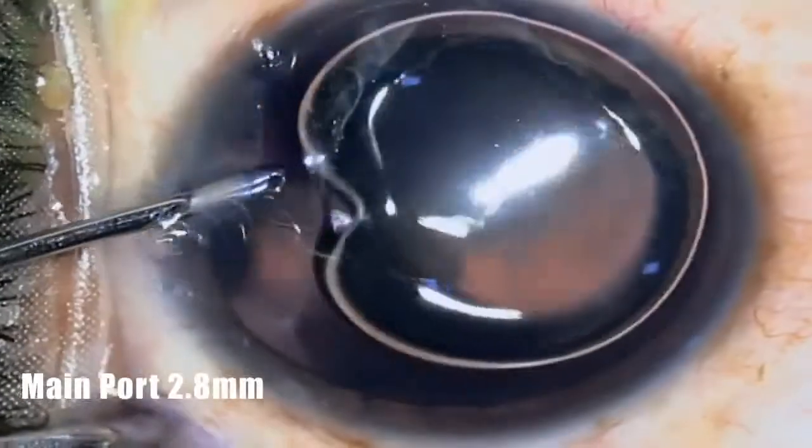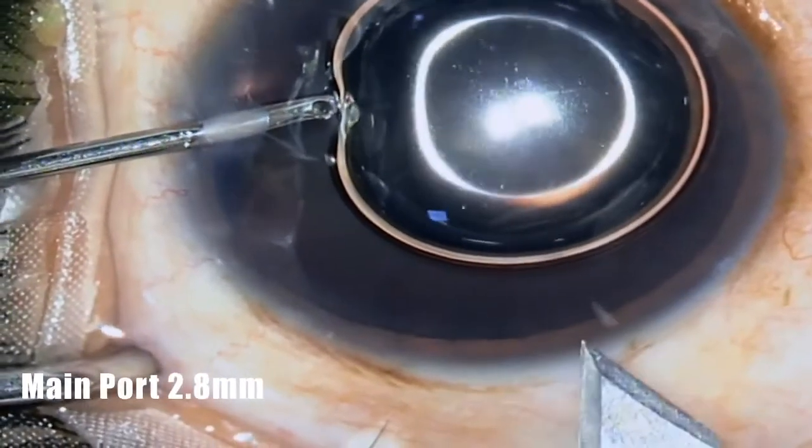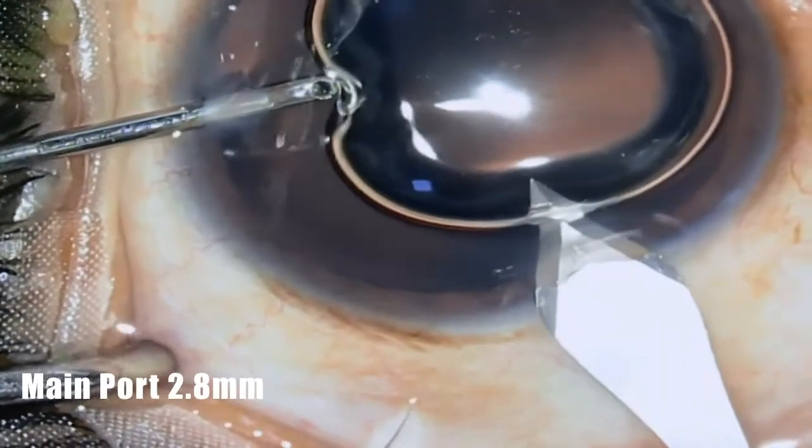Continuous irrigation is used through the left-hand side port to maintain the anterior chamber and to stabilize the globe during main port entry by keratome.